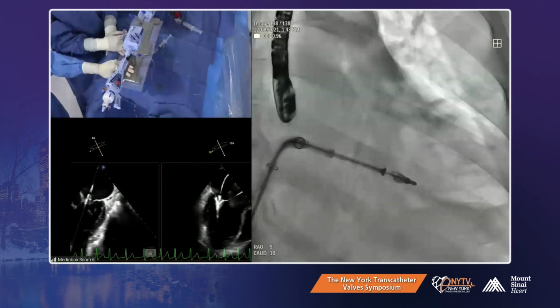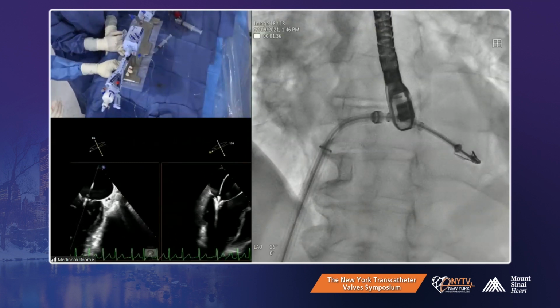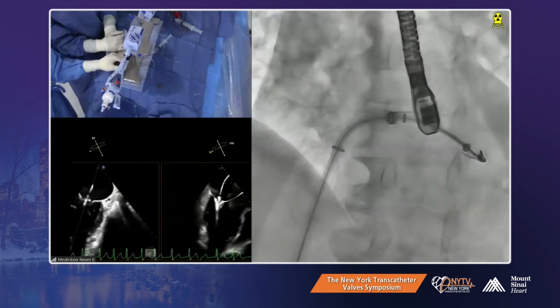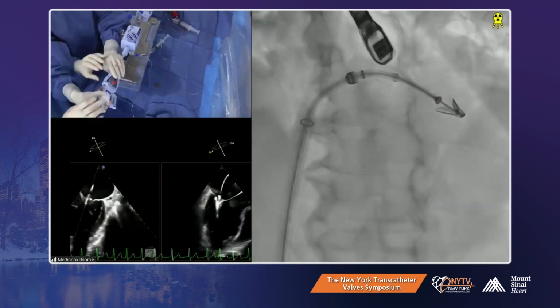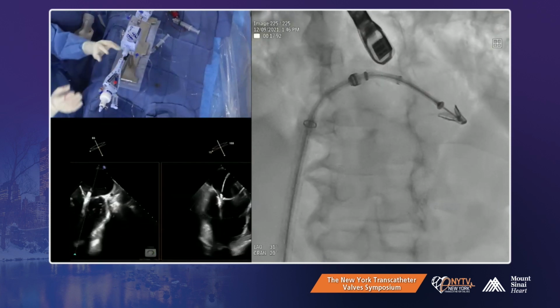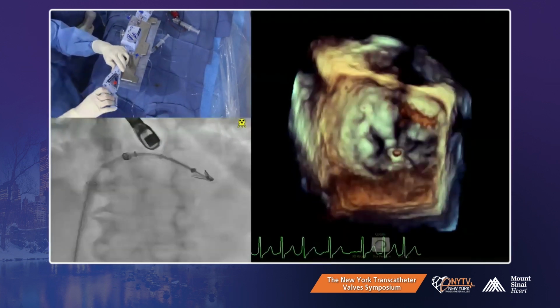Still looks very mobile to me above it. We can optimize if you want, just to check, but it's not going to be easy. It doesn't look close. Can we see 3D with color? You're absolutely right, but we already closed all the way in. So either something is not right. We can undo the fastener again and unlock and make sure. That's a good point. The clip doesn't look closed, even though we already closed it perfectly.